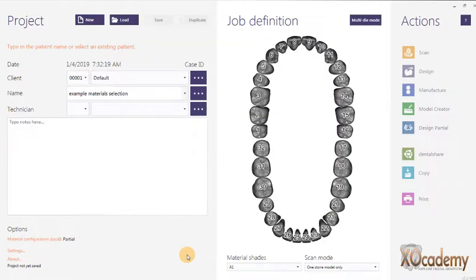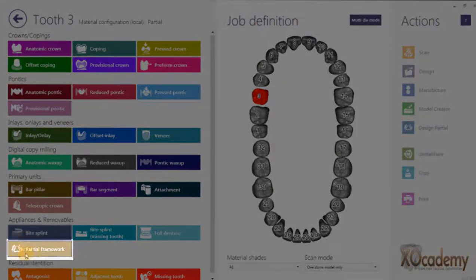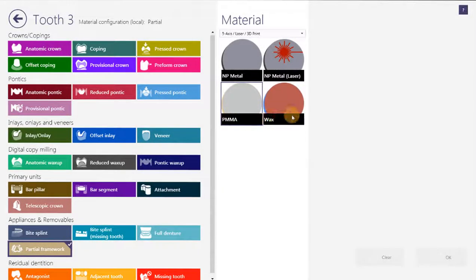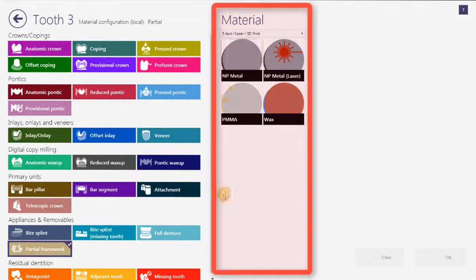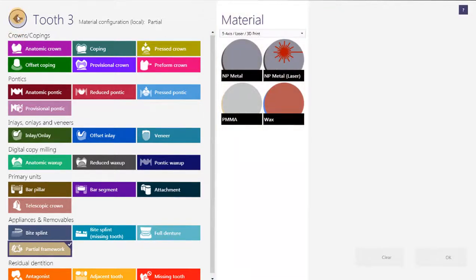That's going to change the work parameters material configuration XML file. Now when I click on tooth number three, I have the partial framework option. I can make this partial framework out of PMMA, wax, or non-precious metal. This middle column is what we're talking about — what options you have available to make whatever restoration you need. That's the materials options or materials configuration.